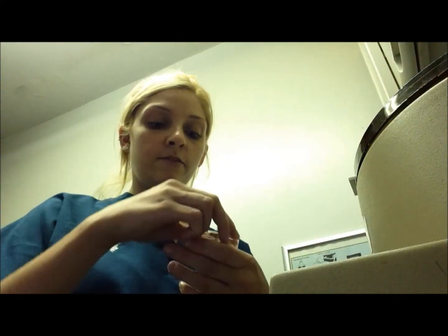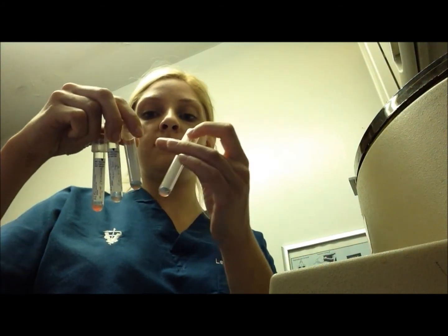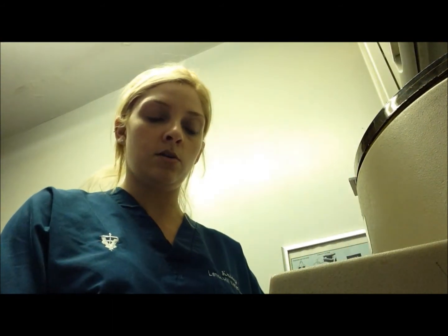So all the samples have been incubating for about 30 minutes. So we have the minor cross match, the major cross match, and the 2 controls. So we're going to go ahead and spin them down. And like I discussed before, you always even them out. And you're going to spin them down at 3400 RPM for about 1 minute. And then we're going to go ahead and look at the supernatant and figure out whether or not they are a match.